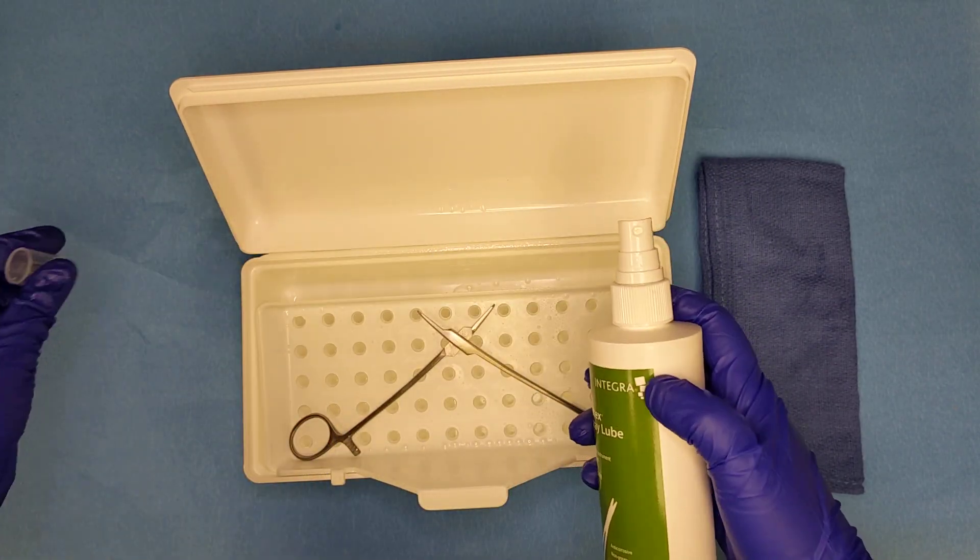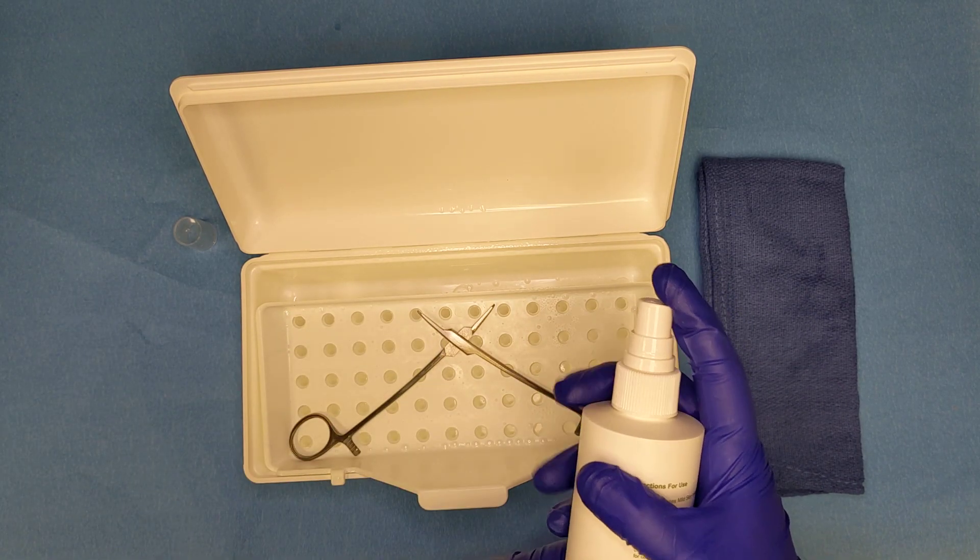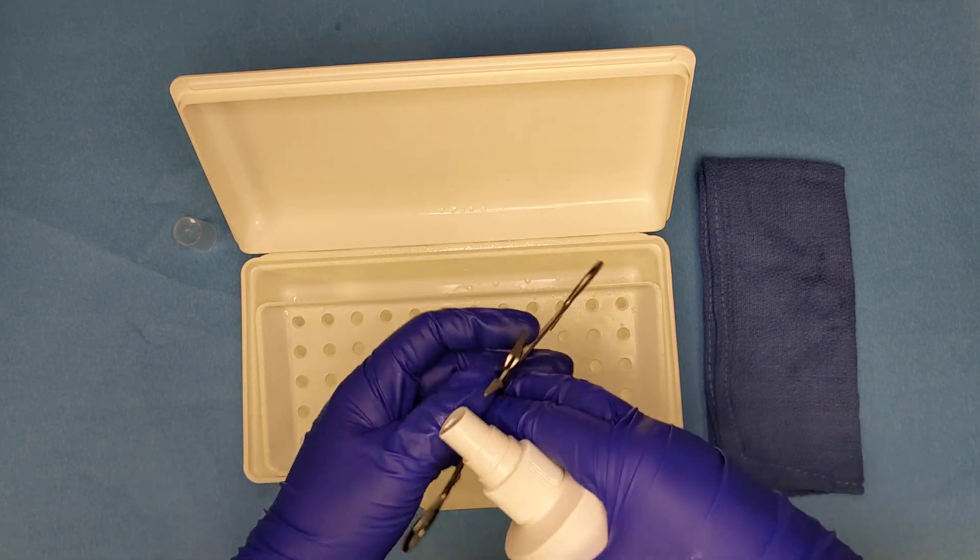Then we're going to apply it to our instrument only at the point where it needs to be lubricated, the moving point. So in this case just apply to the box lock, one spritz on that side, flip it over, one spritz on this side.